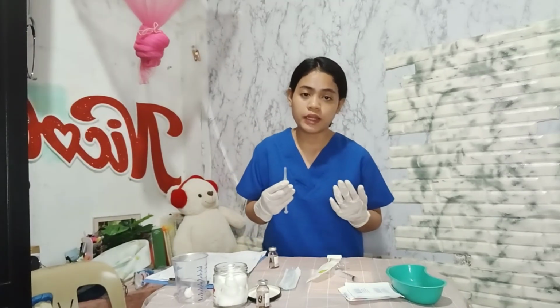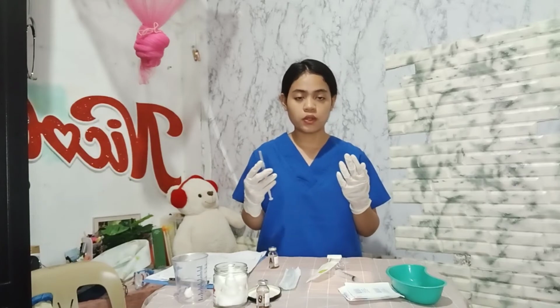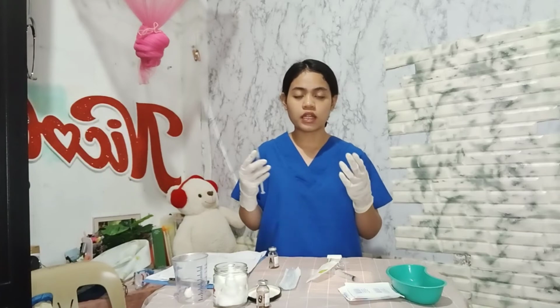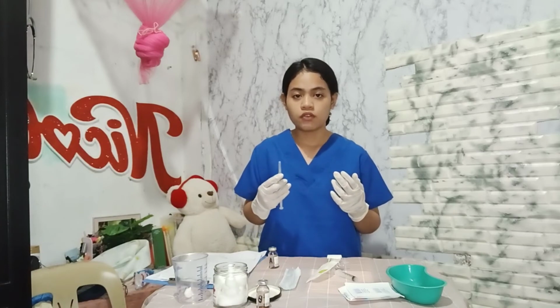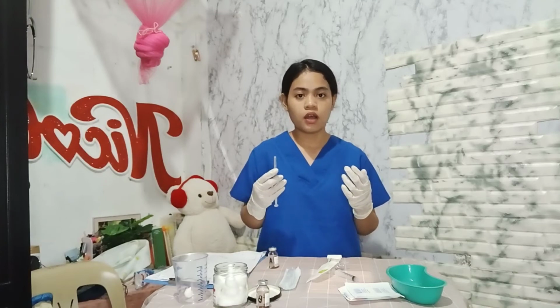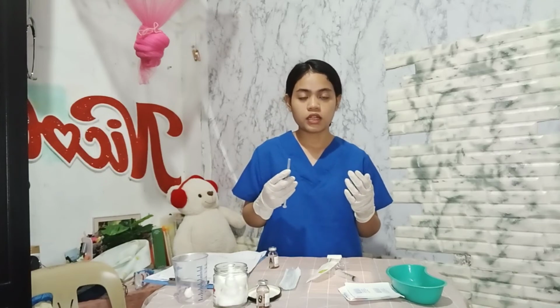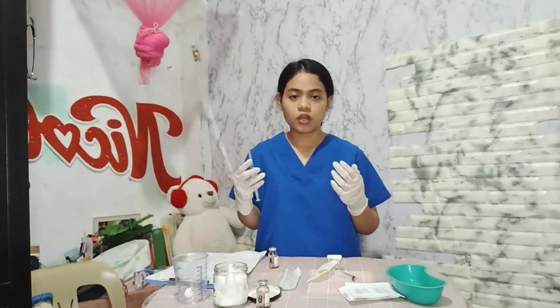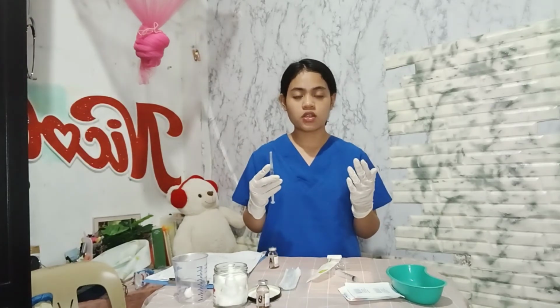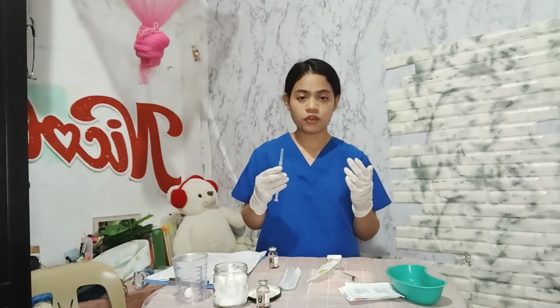For preparing and using multi-dose vials, read the manufacturer's directions and withdraw the equivalent amount of air from the vial, and add the diluent unless it is otherwise indicated by the directions, and add an amount of sterile water or saline indicated in the directions. If the multi-dose vial is reconstituted, label the vial with the date, time when it is prepared, the amount of drug contained in each milliliter of solution, and your initials. Once the medication is reconstituted, store it in a refrigerator or as recommended by the manufacturer.